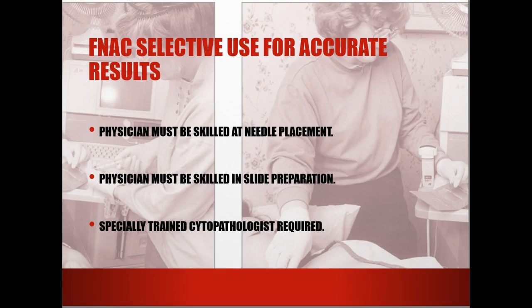Fine needle aspiration cytology is selective use for accurate results. The physician must be very skilled at needle placement. The physician must be skilled in how to prepare the slides. And the cytopathologist has to be specifically trained in looking at these slides. Usually a lot of places will have the pathologist right there. If you're all in the same building, they come down while you're doing it, and the pathologist may gather the slides.